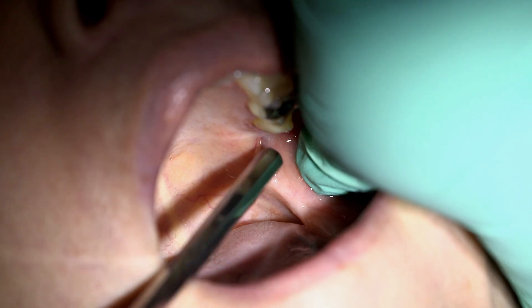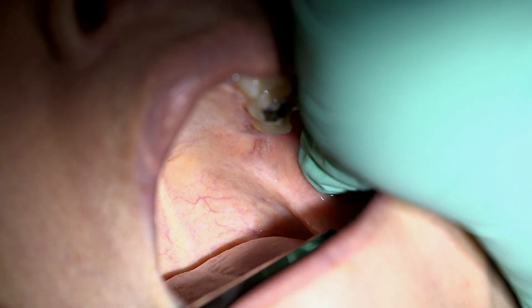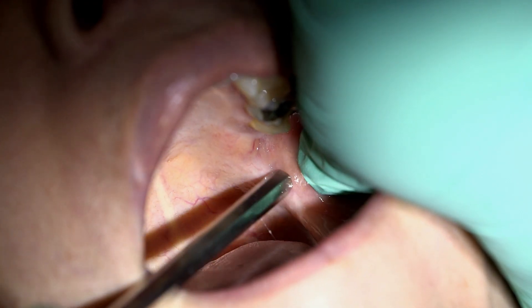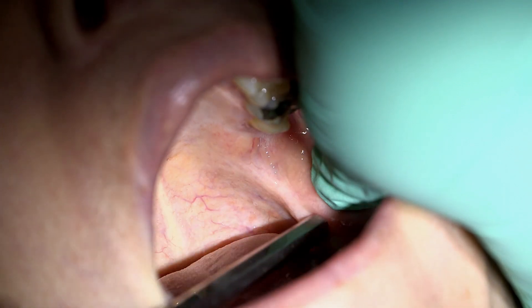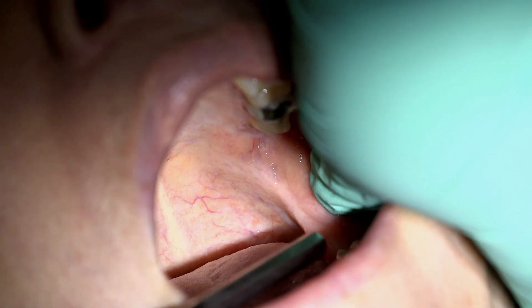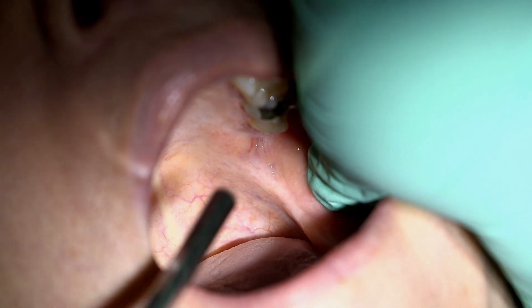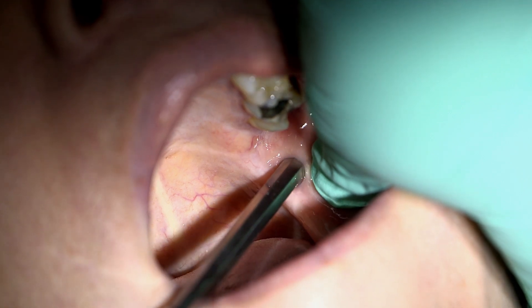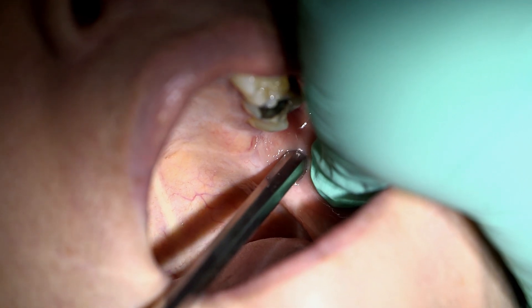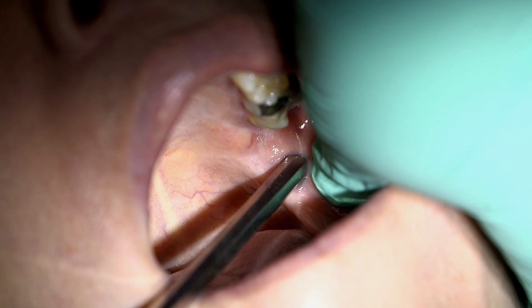Next, we need to identify the pterygo-mandibular raphae, which is this band of tissue. Then we need to identify the pterygo-temporal depression, which is lateral to the raphae. Here we identify the insertion point.